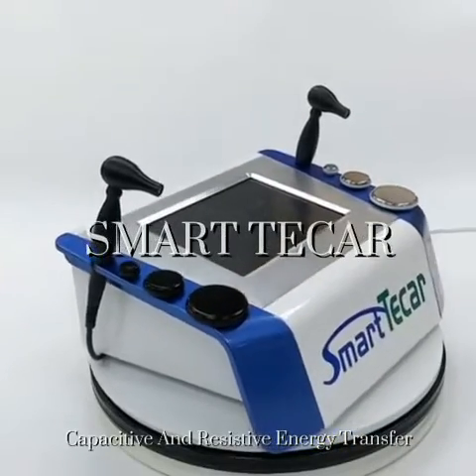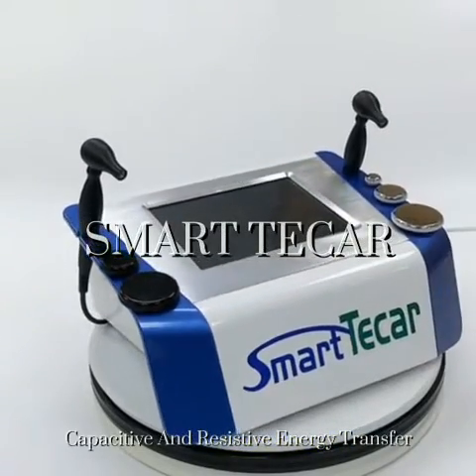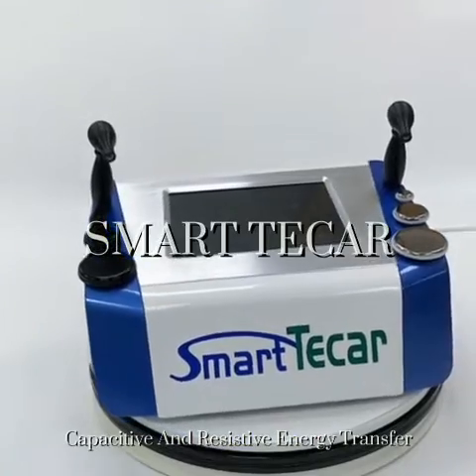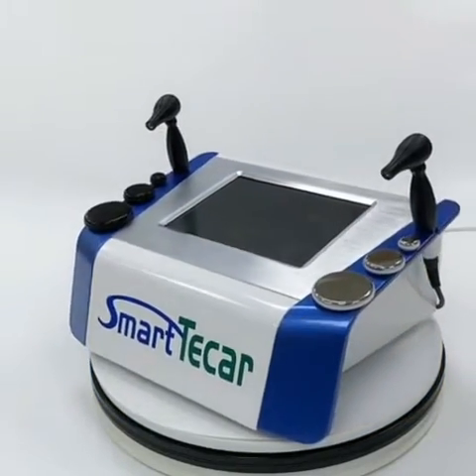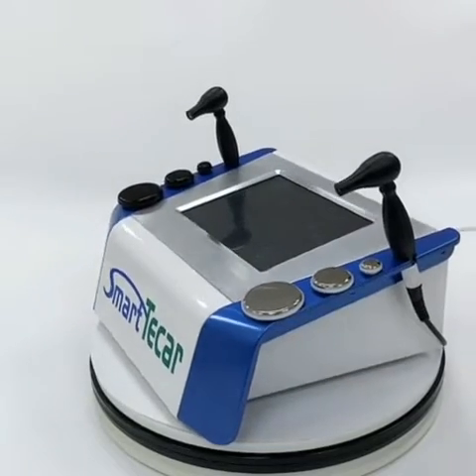Smart Tecar capacitive and resistive energy transfer is used for acute and chronic pain, muscle and tendon disorders, etc., for physiotherapy.